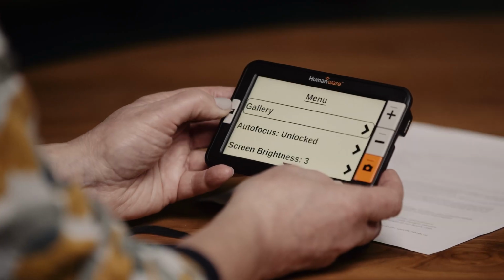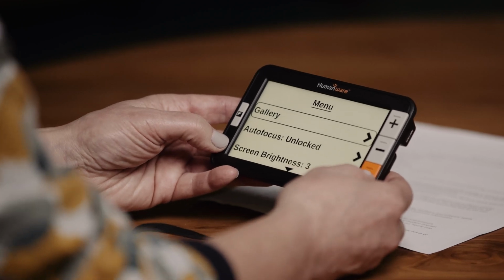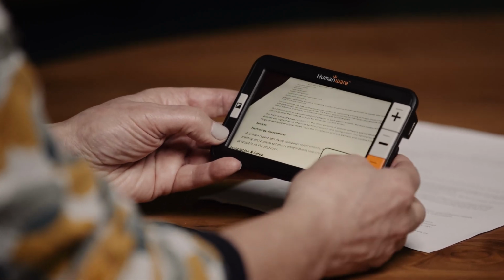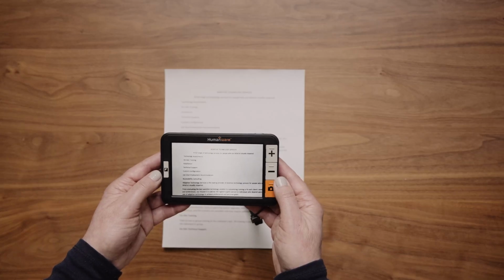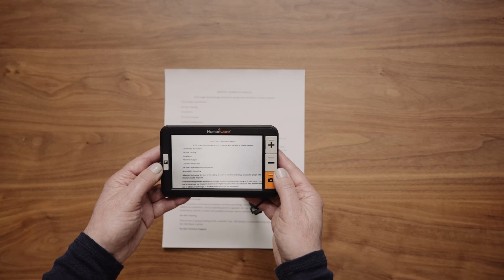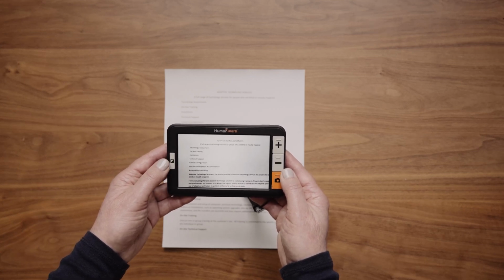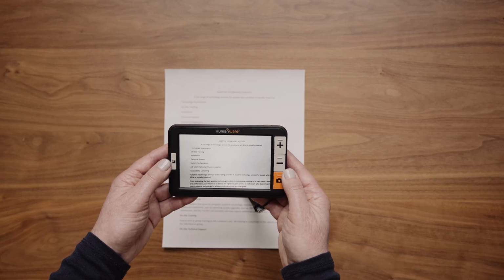View gallery. Saved images are stored in the gallery. When you are viewing an image in the gallery, it is called the gallery mode. Instructions to quickly access the gallery are listed below. You can also view saved images using the Settings menu.